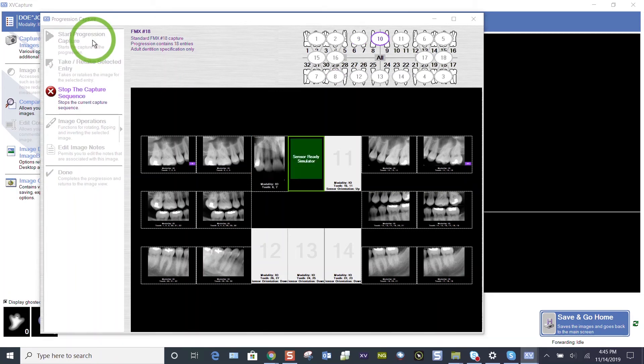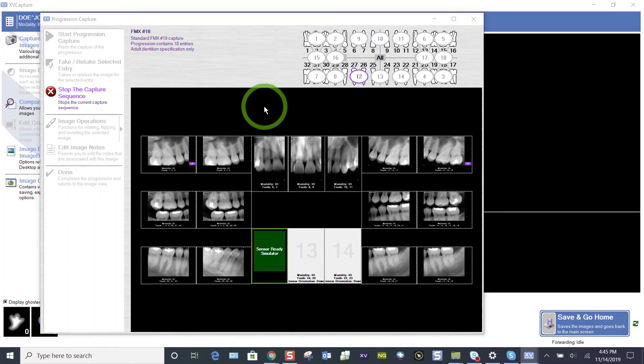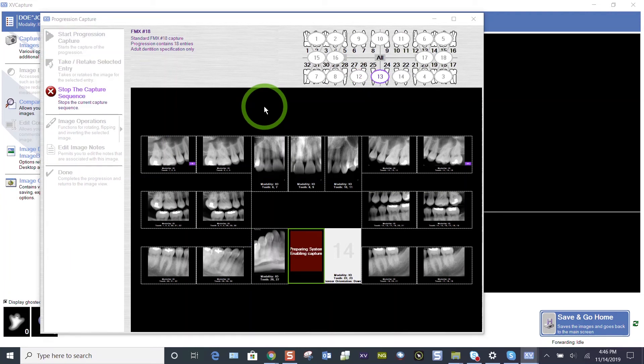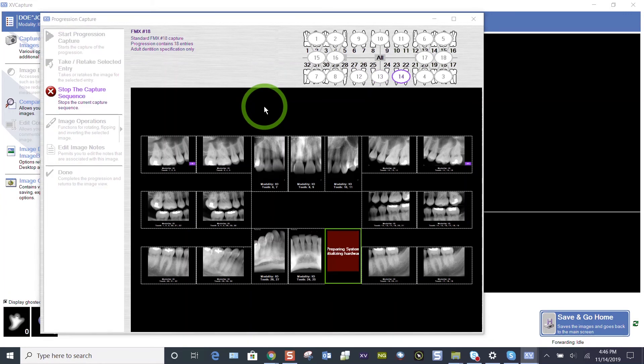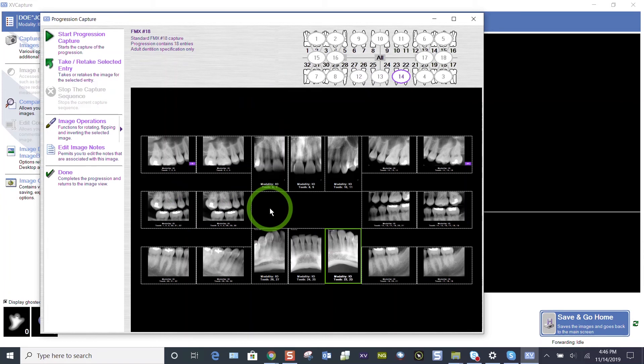Even if the sensor is in ready mode, you can still look at those retakes. You can click on those tiles that you retook on the fly and identify which image you prefer. I retake my FMX 18 images on the fly as I go. And then also I take this moment to assess, do I need a retake anywhere else? Maybe I didn't get the distal of something. I've got a bite wing that's cone cut.